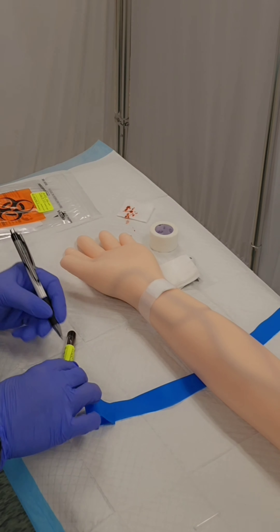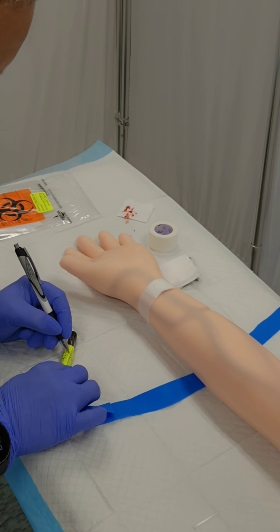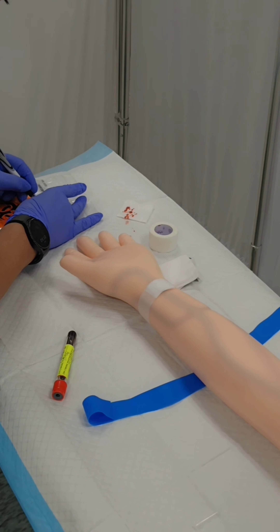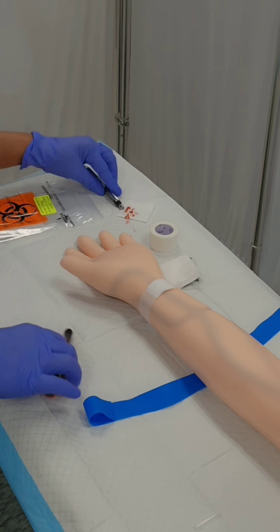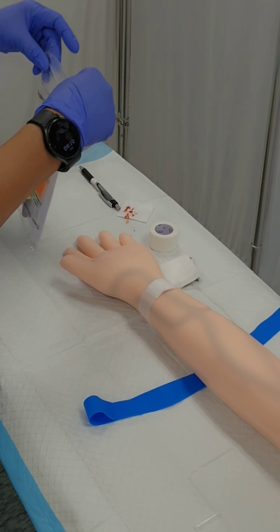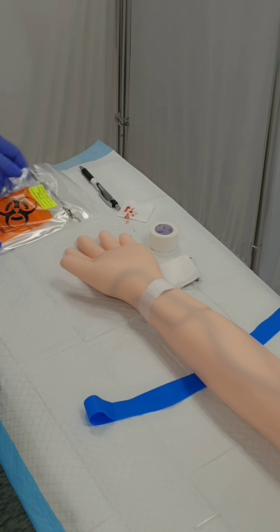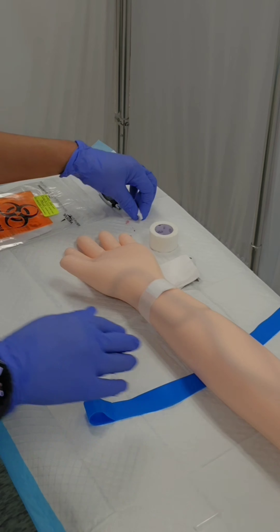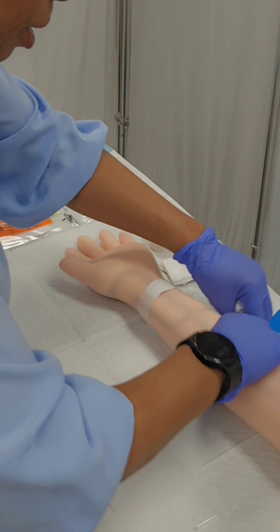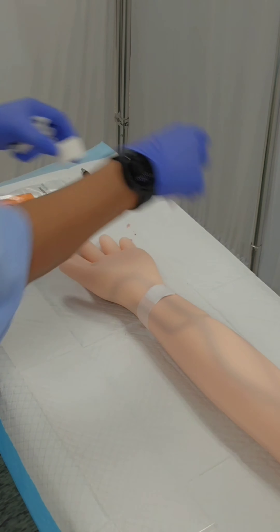Once I've sanitized my hands, I'm going to put on some clean gloves. I'm going to record the time, which was 1608 — I like to use military time, so 1608 is 4:08 PM. Then I'm going to place the lab sample into the specimen bag and clean up all of my trash and dispose of everything.